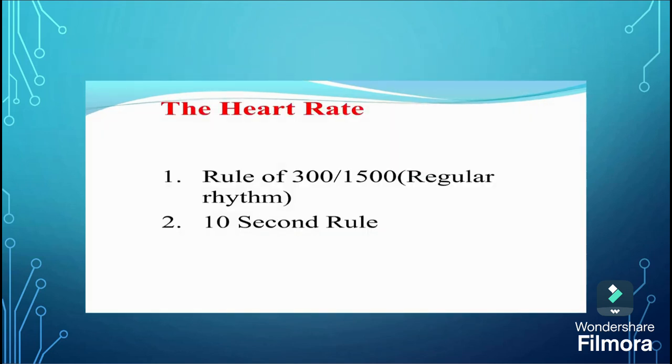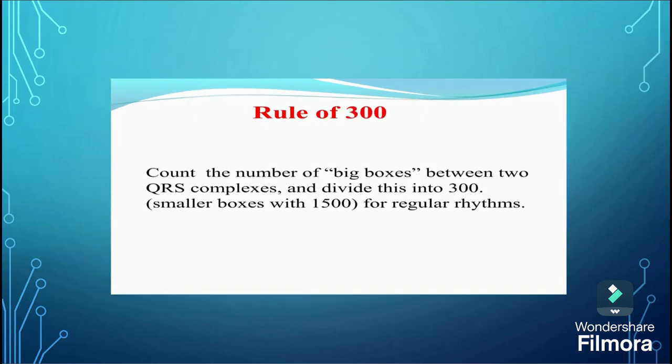Now, heart rate. How will you calculate the heart rate? Rule of 300 or 1500, or the 10-second rule. So, what is the rule of 300?